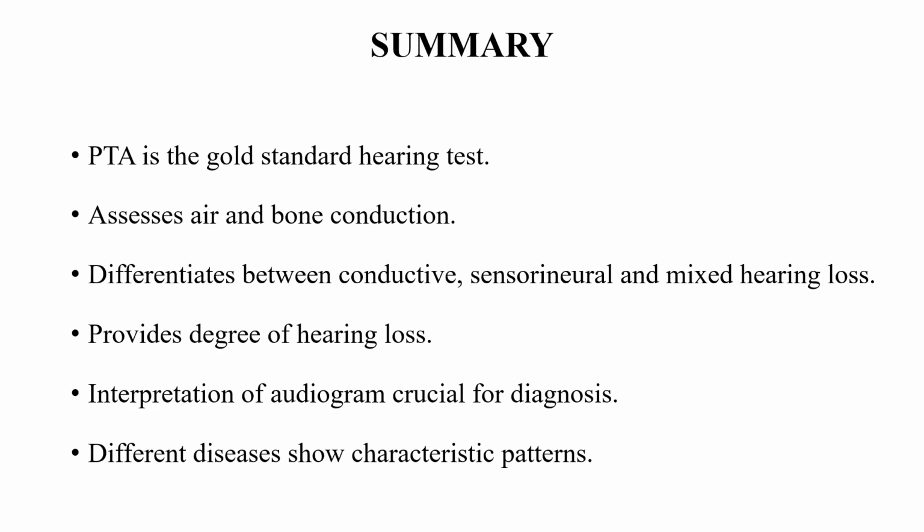So in the end, the summary is PTA is the gold standard hearing test. It assesses air and bone conduction. It differentiates between conductive, sensorineural, and mixed hearing loss and provides the degree of hearing loss. And interpretation of the audiogram is crucial for diagnosis, and different diseases show characteristic patterns which we will see in part 2 of the presentation.